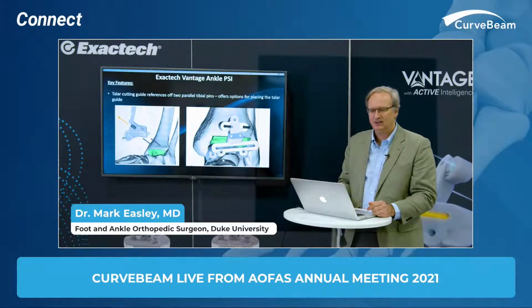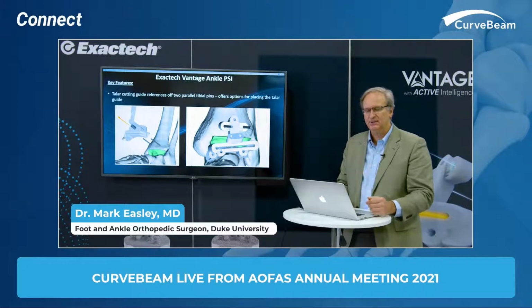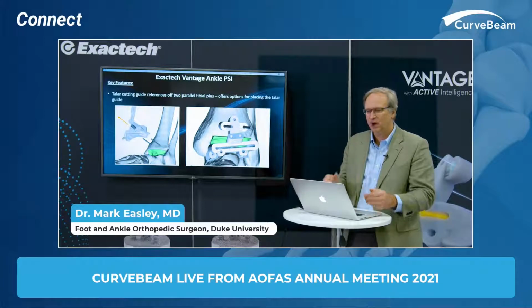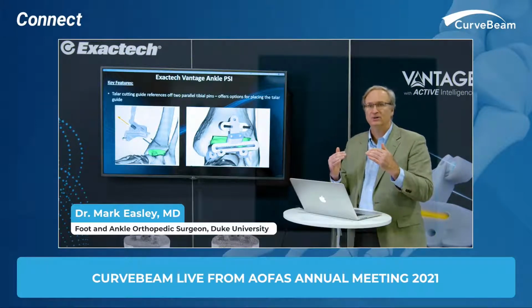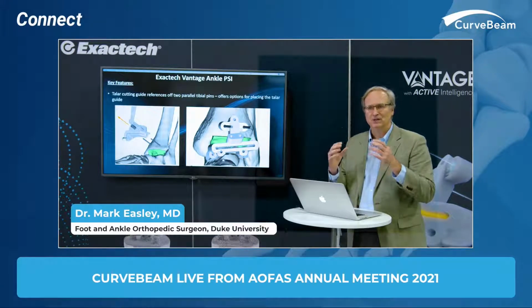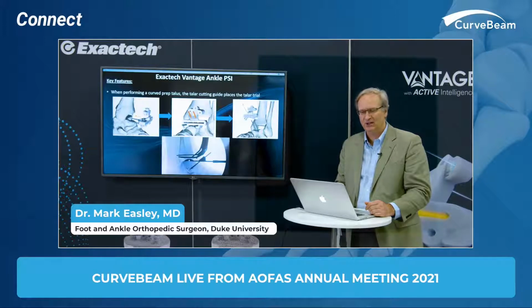So here it is again, the planned tibial cut, and then here is the tibial cut block going on the far image here, and then closer to me, that's off of those same pins in a coupled fashion. I'll have the talar cut block, and it's amazing to me because what I would think would be congruent or orthogonal isn't always the case, and so it's something that I have to get used to seeing, but it may be off axis in what I visualize externally, but the cut's going to be perfectly anatomic the way that I planned it with the engineers.